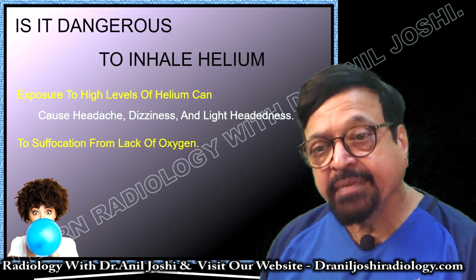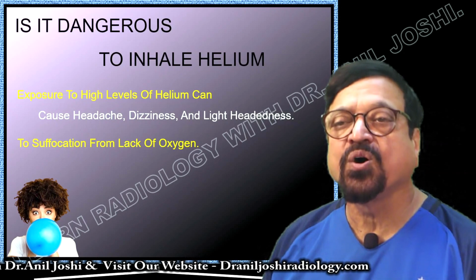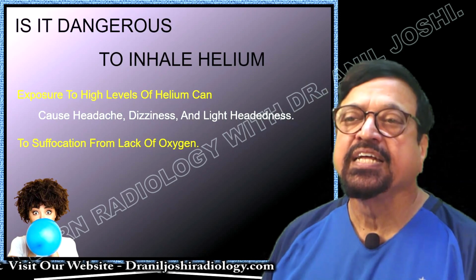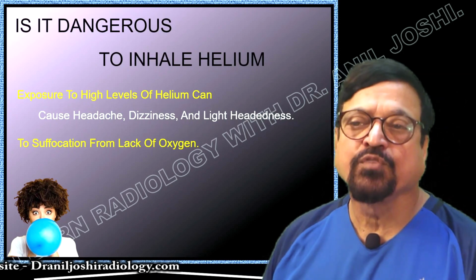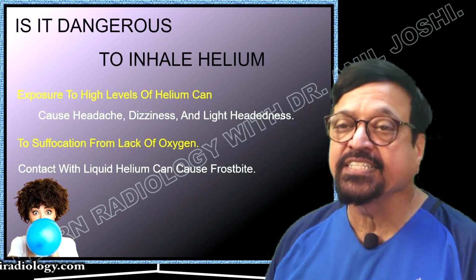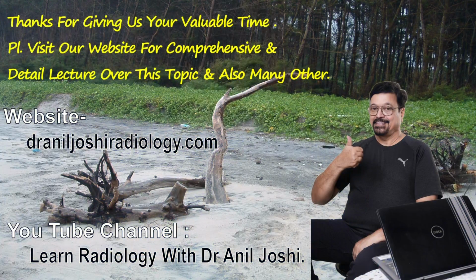There are adequate measures taken so that there will not be quenching. However, when we talk of helium, we have to talk of all its applications, including outside the medical field. That can cause headache, dizziness and lightheadedness. Then there may be suffocation from lack of oxygen in some workers dealing with industrial helium. Then contact with liquid helium can cause frostbite because the temperature is minus 269. But please note, these are not in the medical field. It is elsewhere where helium is used. It comes up as a topic when we talk of helium.